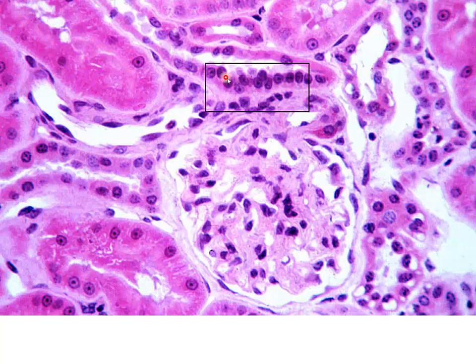Now, remember, the macula densa is part of our distal convoluted tubule. So as we follow this back, we can see a number of nuclei present in our distal convoluted tubule. We see this is fairly short in terms of the height of the cuboidal cells, all indication that we're looking at distal convoluted tubule. We have a number of sections of those in here as well. Here's a section of distal convoluted tubule. And once again, being able to see a lumen is also indicative of that as well. Here we see a distal convoluted tubule. We can see the lumen, but the number of nuclei are going to point to that as well.